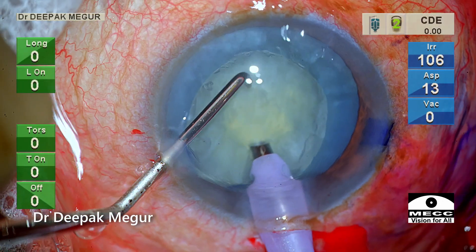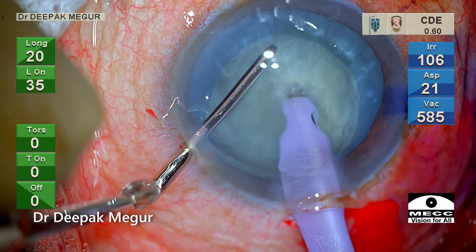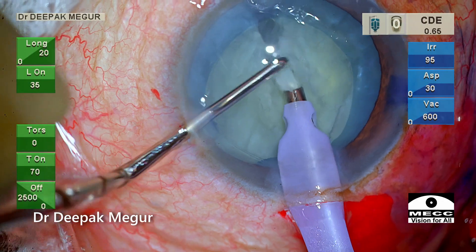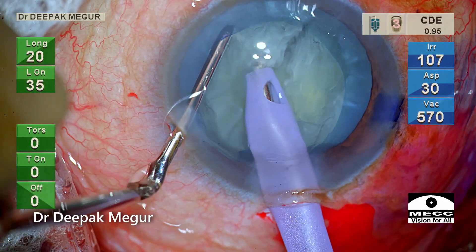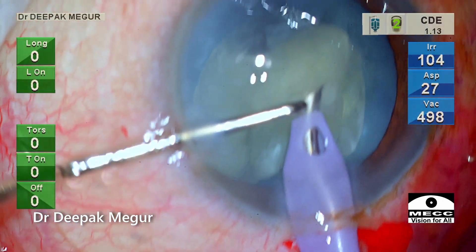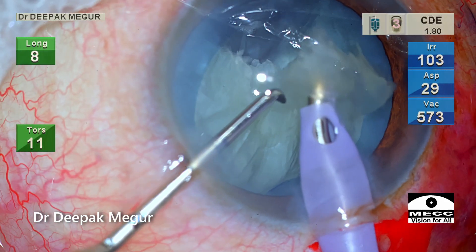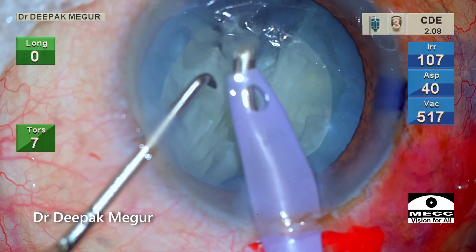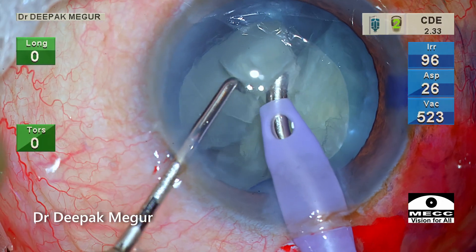The nucleus is soft, so dividing it into smaller fragments will not be difficult. A vertical chop is performed and the first heminucleus is again divided, giving a small pie-shaped piece which is pulled out of the bag and then emulsified in the anterior chamber. This is a critical step because removing this one piece out of the bag creates space within the bag, inducing lesser stress on the torn edge of the anterior capsule.